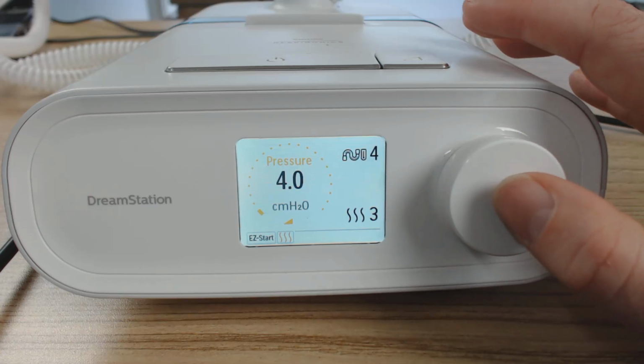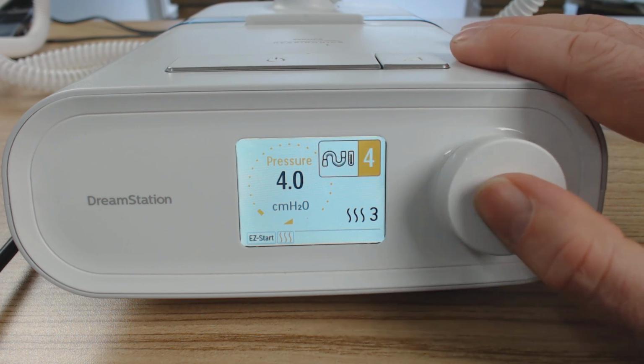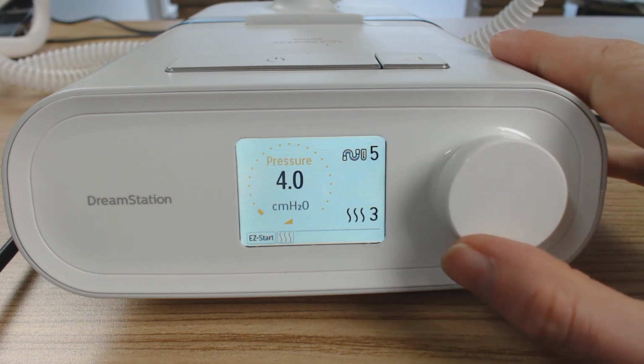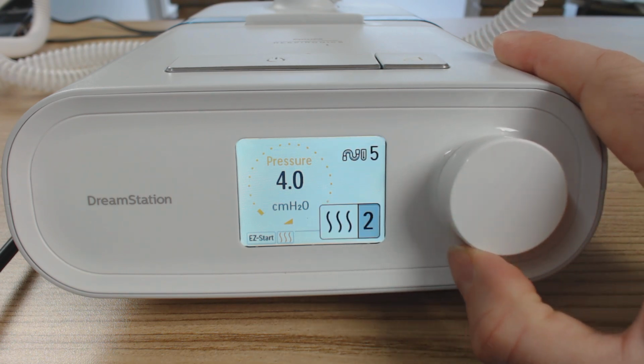So if we're getting a lot of rain out, a lot of condensation, we probably want to have this heated tube up hotter, okay? Because what that means is it's going to insulate that humid air that's running through it from the cold outside air. If we rotate down here, we can also change the level of moisture in the air.